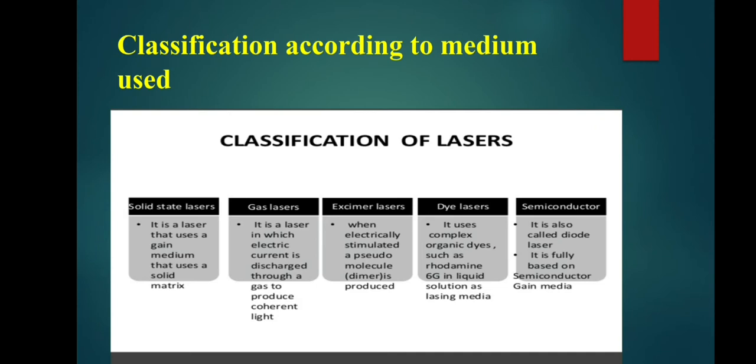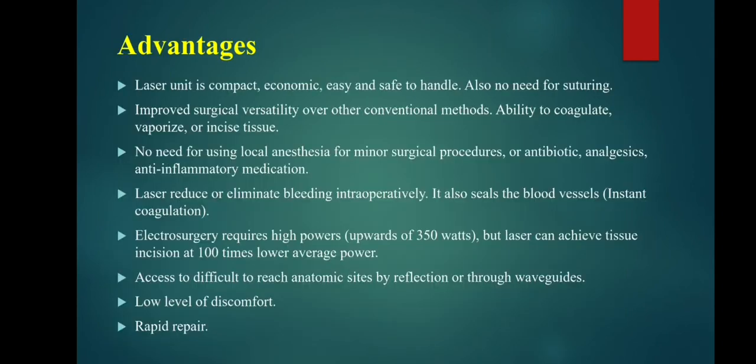Dye lasers use complex organic dyes such as rhodamine 6G in liquid solution as lasing medium. Semiconductors, also called diode laser, are fully based on semiconductor gain media.